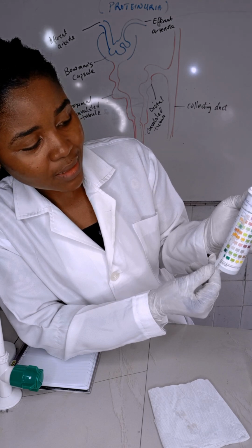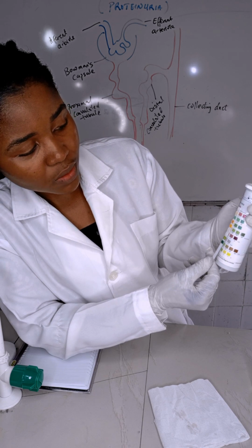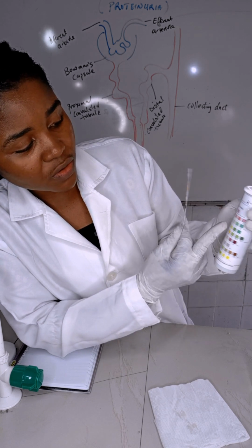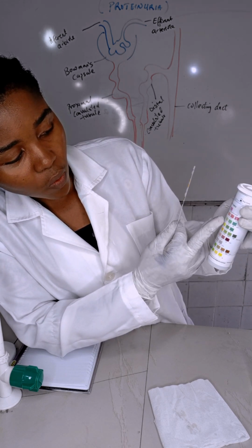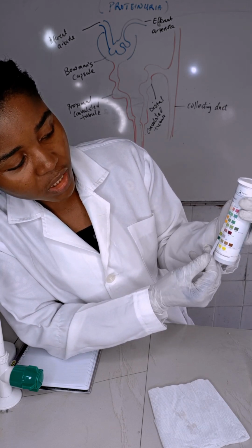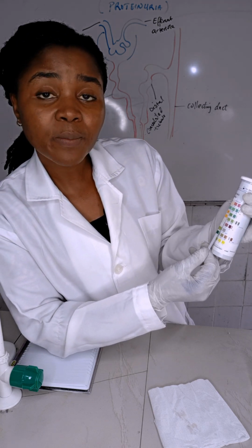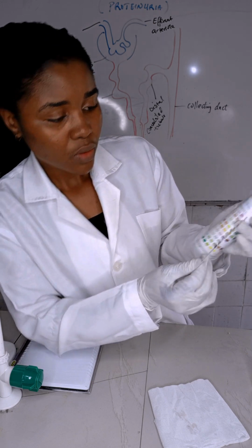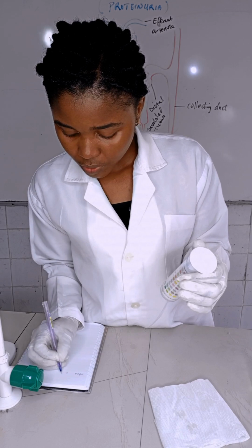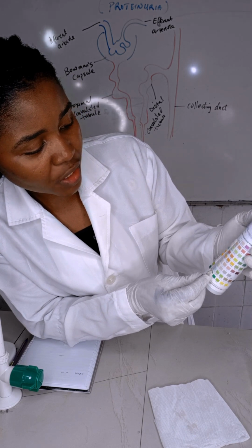It was light green, greenish yellow. But now look at the transition. You see where it matches? Matches this, which is 2 plus. They give you the grading: negative, trace, 1 plus, 2 plus. So which one does it correspond with? To me, it corresponds with 2 plus. And that is why you must take this reading under a bright light. So you quickly note protein 2 plus. Okay? You go ahead and check the next one, pH.